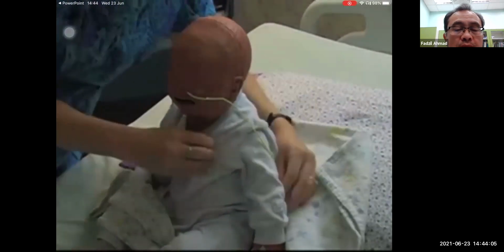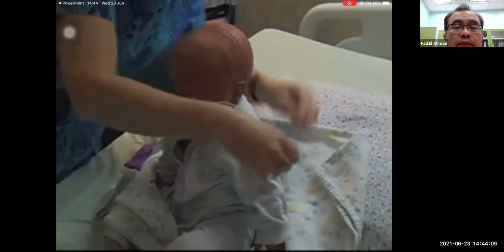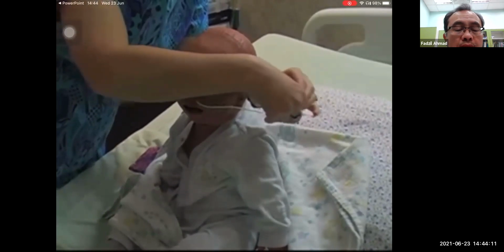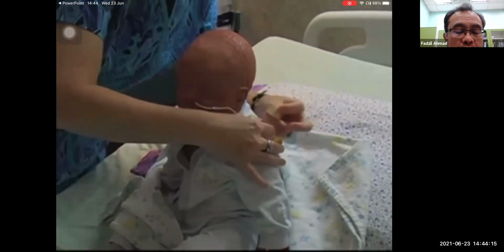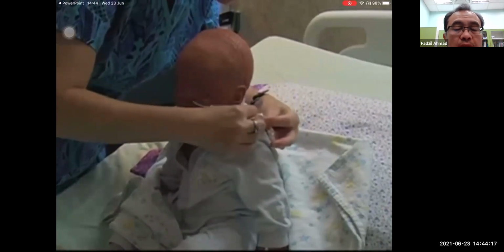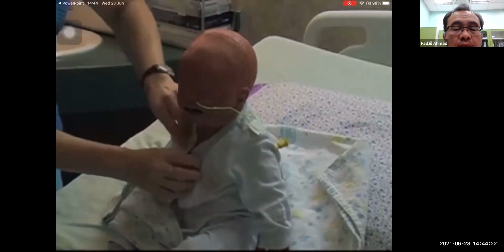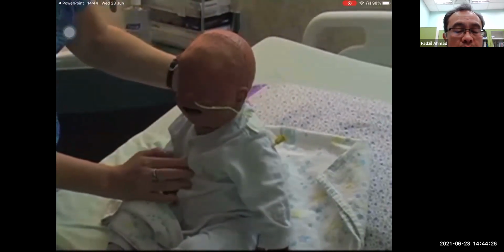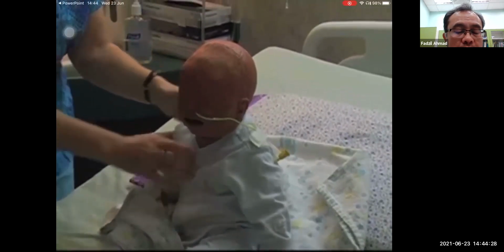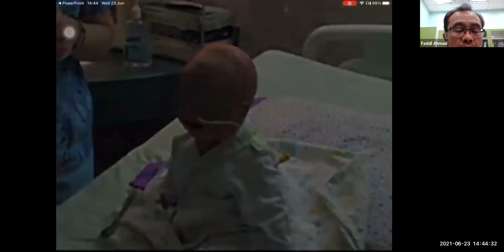If we leave the tube hanging, then we're more likely to have the tube come out. This is where you can get creative, or you can do something as simple as taping the tube to your child's outfit. Just keeping it out of their way, taping it to the shoulder is a good idea. You could also pin it to their clothing as well. This way, it'll keep the tube secure and less likely to come out. Once the tube is secure, it's ready to use, and at that point, you're just cleaning up and putting your things away.